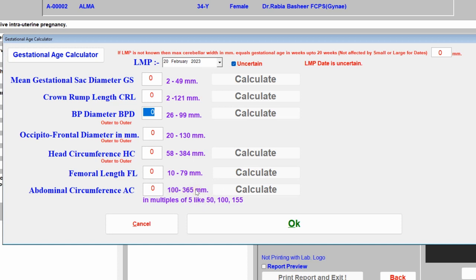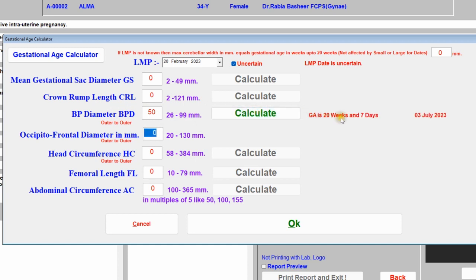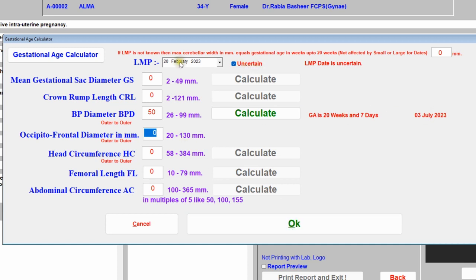The abdominal circumference can range from 100 to 365 millimeters. Suppose the patient's BPD was 50 mm and you enter only this biometry. Enter 50 in the BPD field and click 'Calculate'. The fetal age is calculated as 20 weeks and 7 days, and the EDD is displayed as 3rd July 2023.